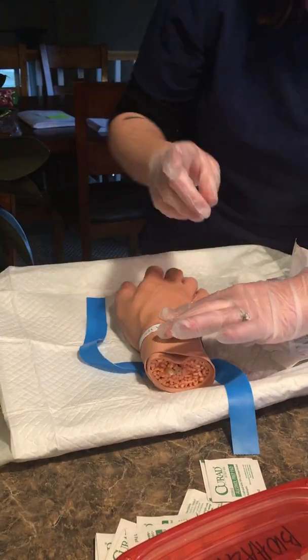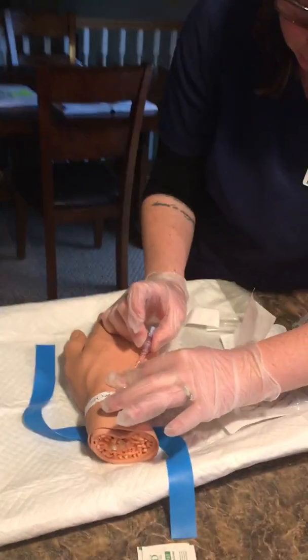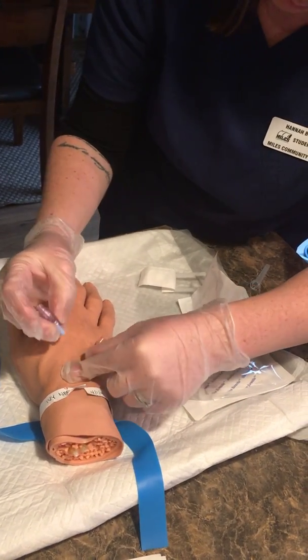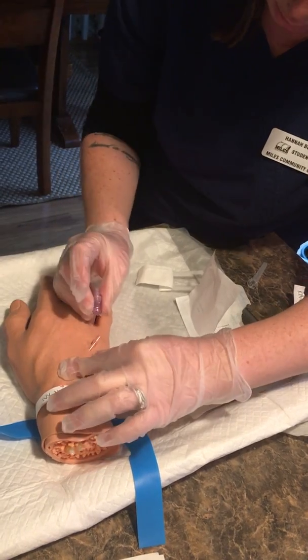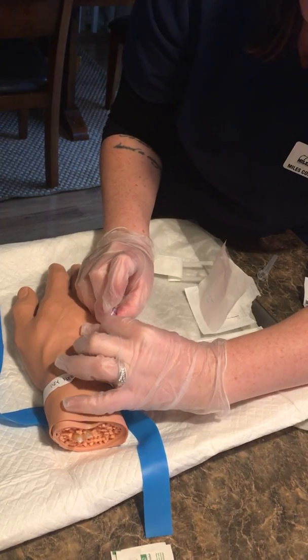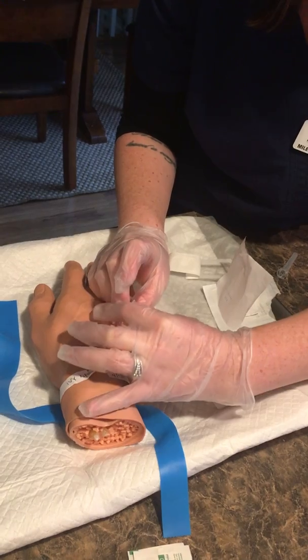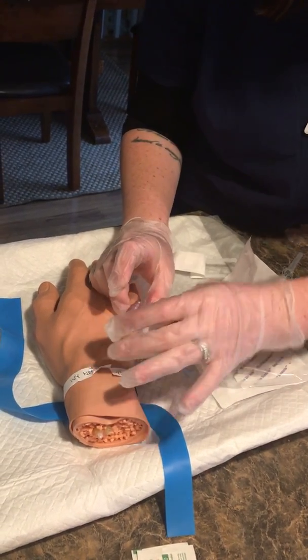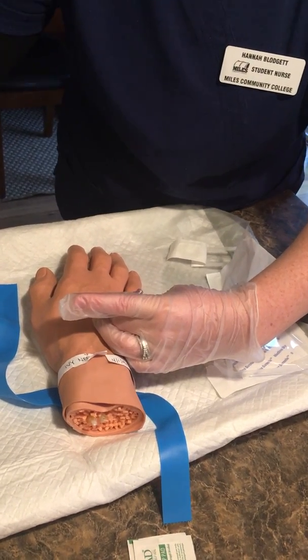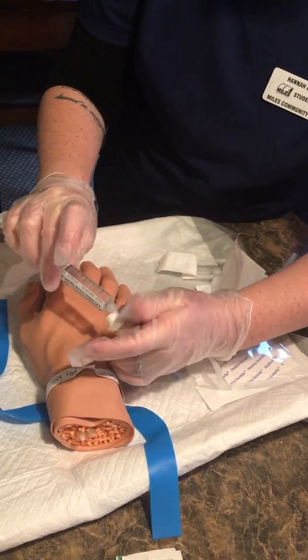I'll discard the needle and then get my saline lock end attached as soon as I can. I want to make sure that is stabilized so that I'm not twisting the catheter inside the vein. Once that's on, I can go ahead and grab one of my flushes.